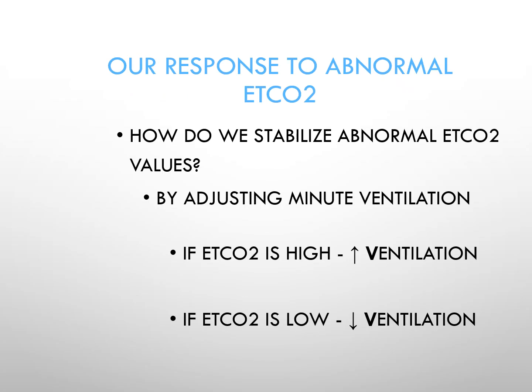So when I did the introduction to this presentation, I did mention that in some cases we'll talk about, now that you have, for instance, an abnormal value, what is the clinical team's response to that abnormal value? Now, you guys learned this in respiratory school. If you happen to be a nurse, you've learned it in nursing school as well. But it bears some repeating or review at this time. So, broadly speaking, the response to an abnormal end-tidal CO2, how do we actually stabilize these values?